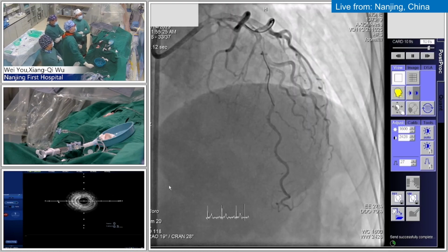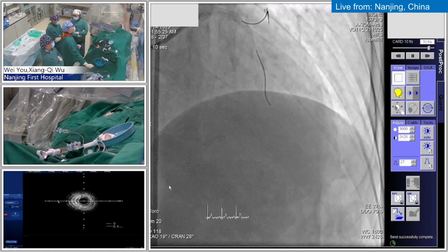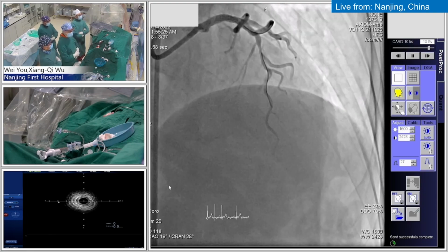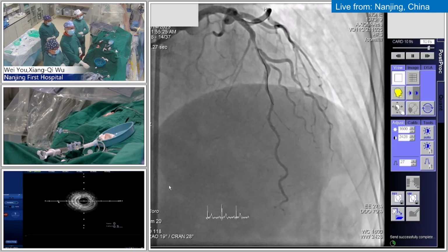Just according to advice, I think for the physiology test, like the QFR, I think is okay. Yes, I think let's do that. And if we can accomplish that in the next 4 minutes, we'll provide a good response.